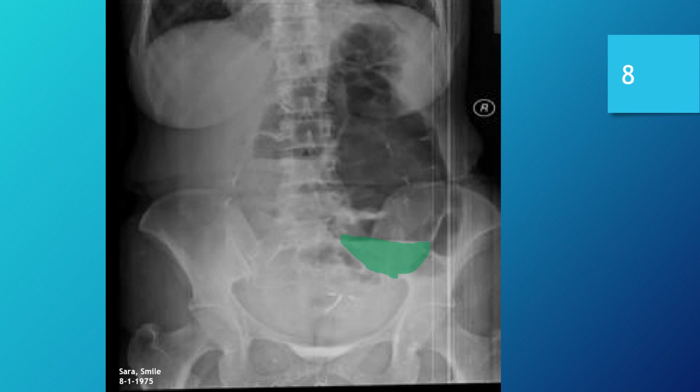And then above that, in this area right here across the bowel, it appears to me to be fluid settlement, and of course the air up above that area leads me to believe that this is an upright abdomen. We don't have any indicator otherwise, but that is my belief.